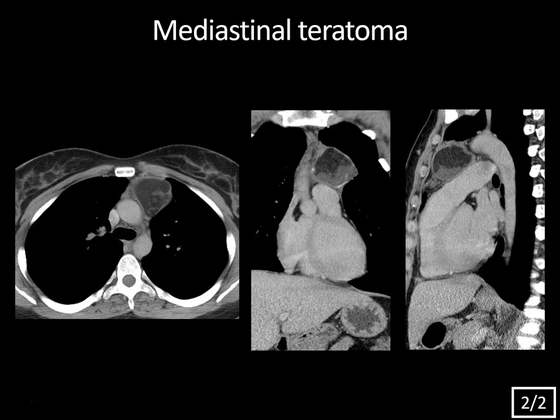This is a mediastinal teratoma — a germ cell neoplasm that usually has detectable fat, and may also have soft tissue, calcification, and occasionally fat-fluid levels. If you're lucky, you'll see formed teeth within them. Mature teratomas are the most common and are benign. Immature teratomas are more solid-looking and still have an excellent prognosis in children, but can have a malignant germ cell tumor component that needs further evaluation.